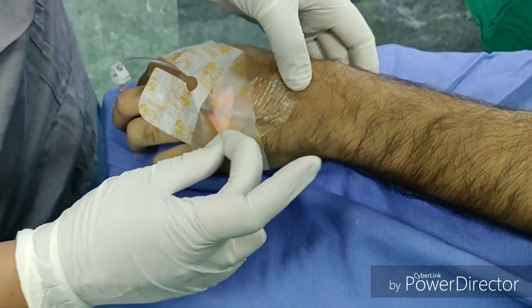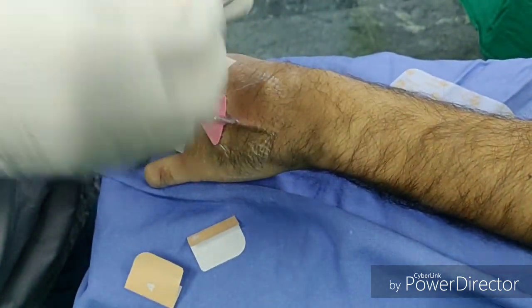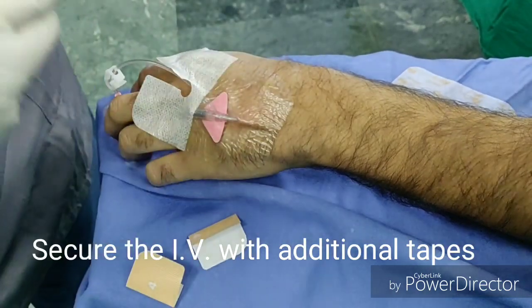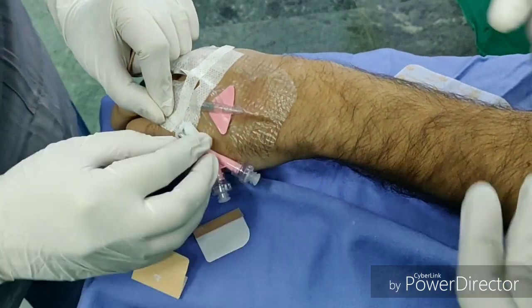Stabilize and secure the IV line with additional tapes, as it prevents micro movements of the device within the vein and also prevents the IV from getting accidentally pulled out.